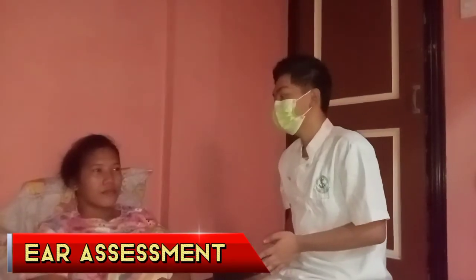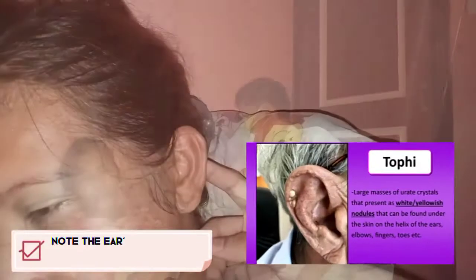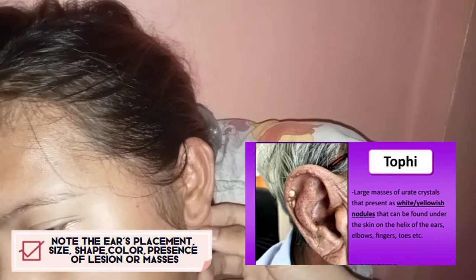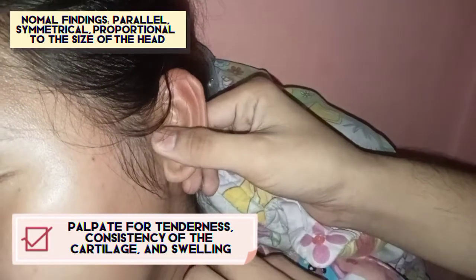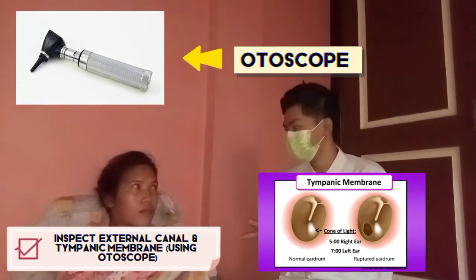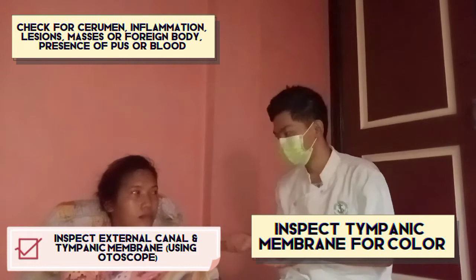Okay, ma'am. At this moment, I'm going to inspect your ear. Note the ear's placement, size, shape, color, presence of lesion or masses. Next, palpate for tenderness, consistency of the cartilage and swelling. Next, inspect external canal and tympanic membrane using otoscope.